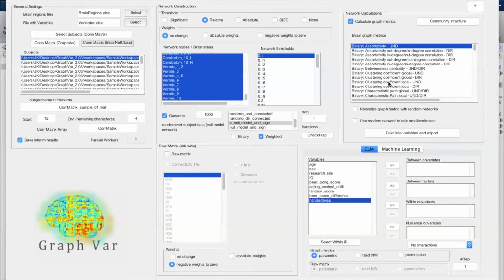If you are not acquainted with what this actually is, it would make sense to look at my other videos where I give you a little bit of introduction into some core concepts and how those can be categorized. But most importantly, you will probably have a look at the site of the Brain Connectivity Toolbox.